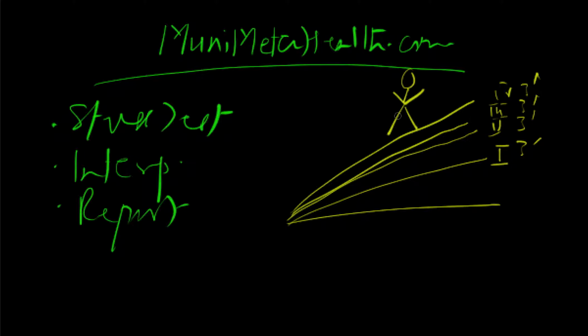Now, there are certain prerequisites for the patient. Obviously, when he or she is arriving at your office, should be nil orally. In other words, should not have had any meal for at least 2.5 hours. Because remember, an hour and a half, 2 hours is your gastric emptying time. So to avoid any nausea, vomiting, and also redistribution of blood flow into the splanchnic system, you really want to have that patient fasting for about 2.5, 3 hours. This way you can perform the test well, number one.